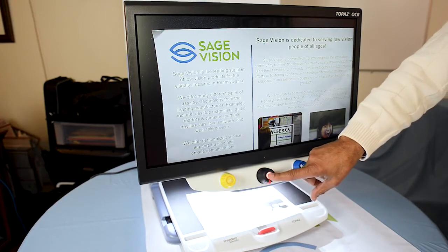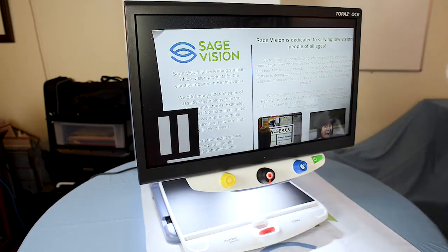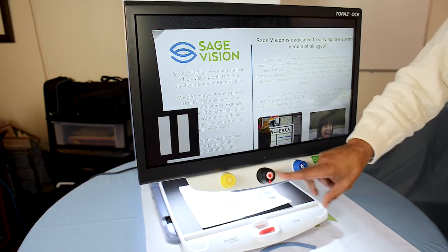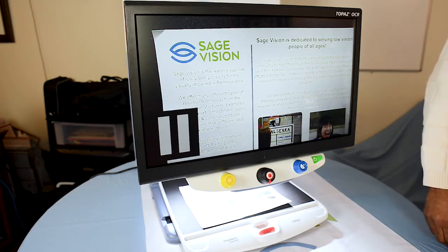If you're reading a menu and you wanted to freeze the frame, you can take the document away and the picture will still remain on the screen. This is great for if you wanted to take a freeze frame of a picture of your family, or even if you're doing a crossword puzzle and you'd like to zoom in and freeze the frame.